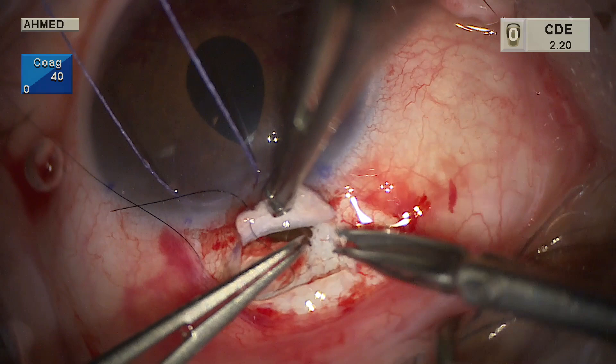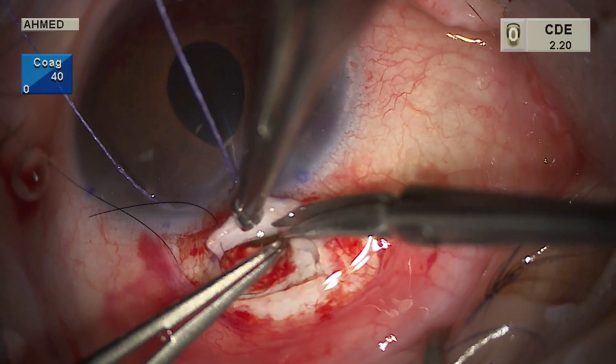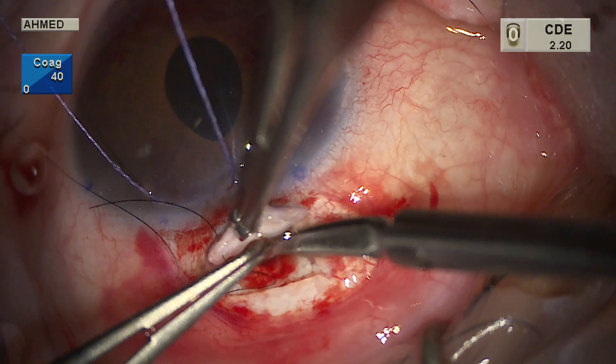The iridectomy is made as a broad-based iridectomy by pulling the iris out of the ostomy, moving to the right and cutting, then to the left and cutting. This creates a broader iridectomy to prevent iris entrapment into the ostium. The iridectomy is visible through the ostium that has been made.